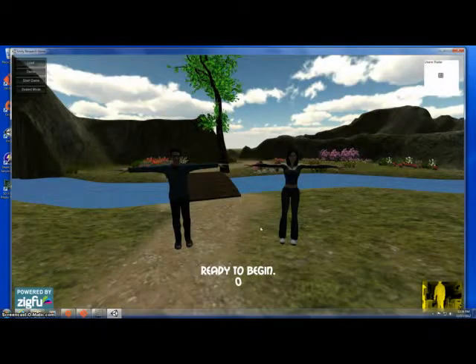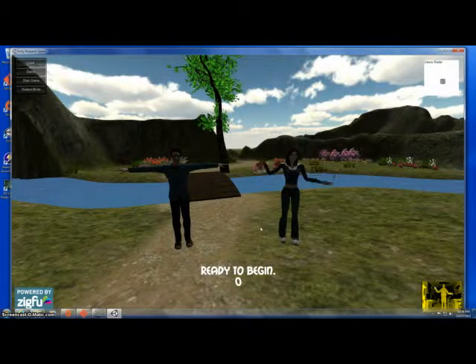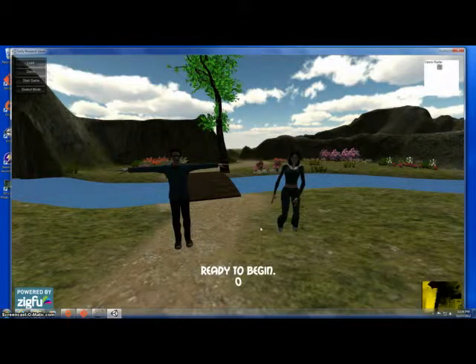Once the game file has been opened, the patient will see that they're controlling a character on screen. Every movement the character makes is being followed by the female character on the right-hand side of the screen. Now, to actually begin the game, the patient is going to use the interface at the top left of the screen to load the correct exercises.